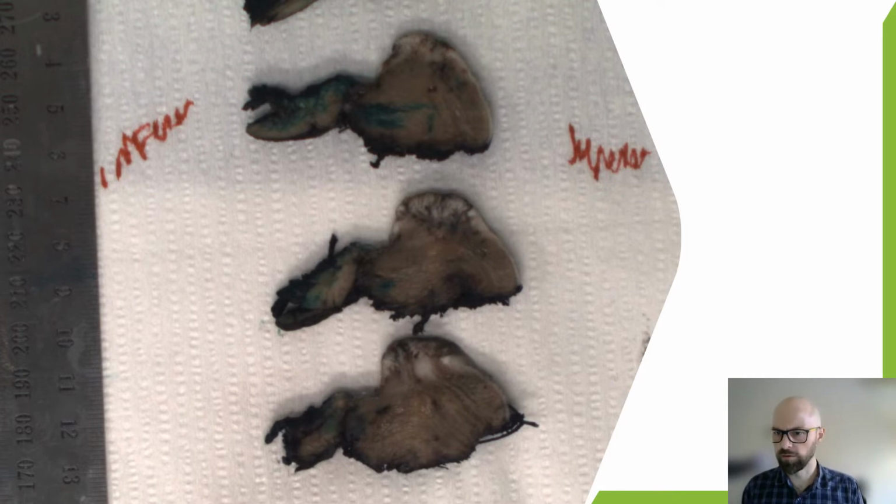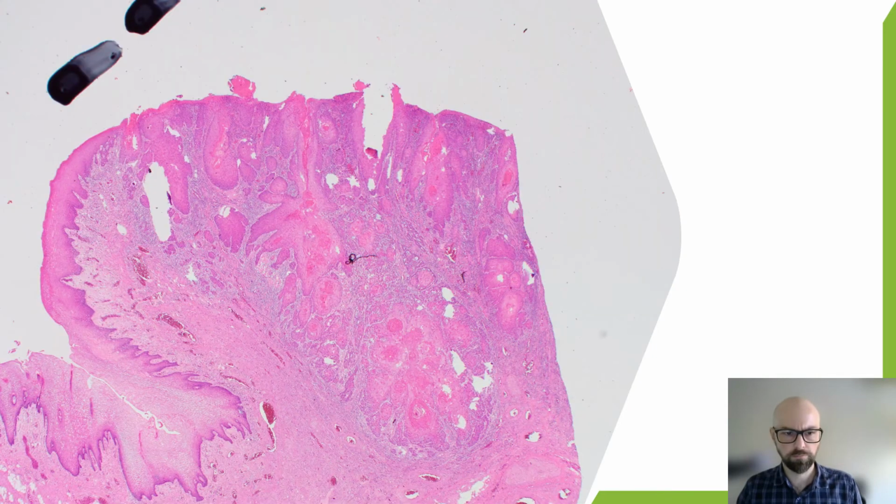Depth of invasion is also supposed to account for exophytic tumours and not overstate how far down they actually invade. However, there's cases like this where we do have an exophytic tumour, but what happens is the tumour just gathers the normal mucosa around it and pulls it up and pushes it out. And so this is the slide of that case. And you can see if the tumour wasn't there, the normal mucosa would track along here, but the tumour itself has gathered up the mucosa and pushed it out. And so in the staging manuals, it's not very clear on how to take the depth of invasion here.